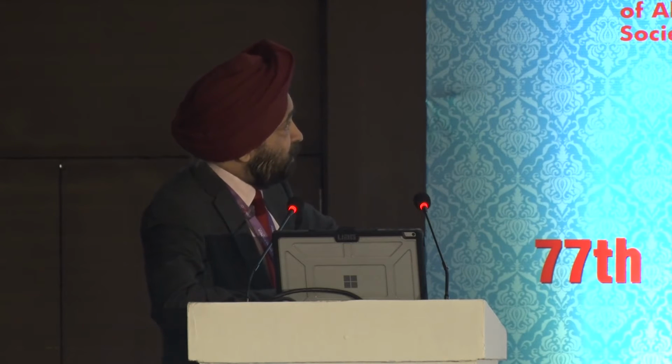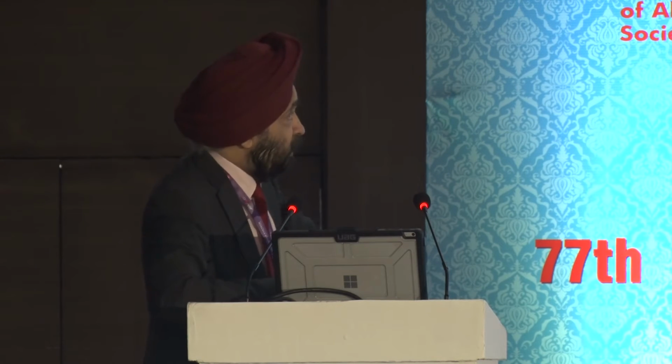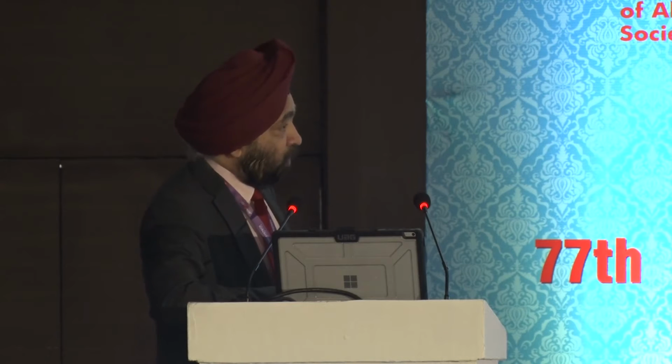This is another case with the femto which I am wishing to show you. This is a small pupil. This is a subluxated lens, and you can see that this is 5.5 millimeters. You can see that the pupil is somewhere around less than 4. So what we are doing is putting in a Malyugin ring. As you see, the Malyugin ring is being inserted.